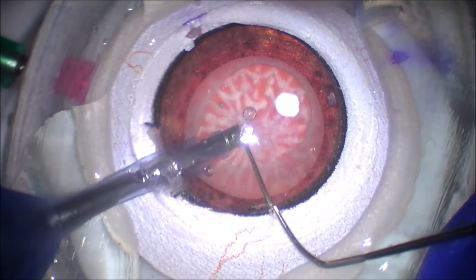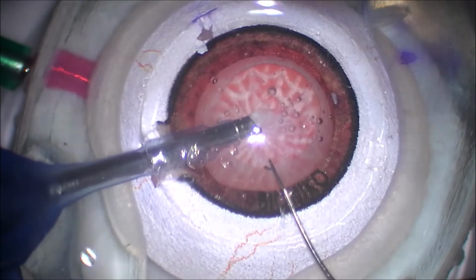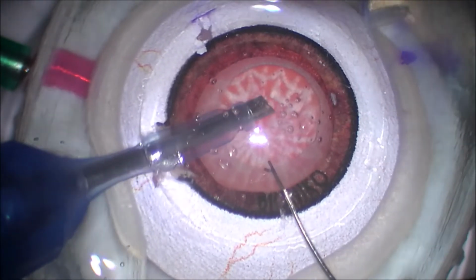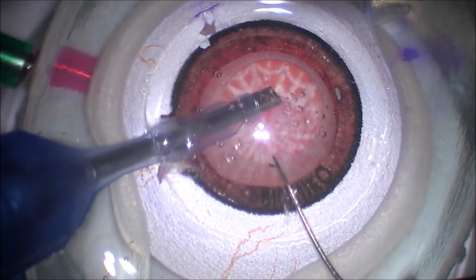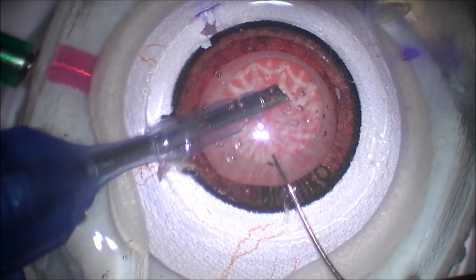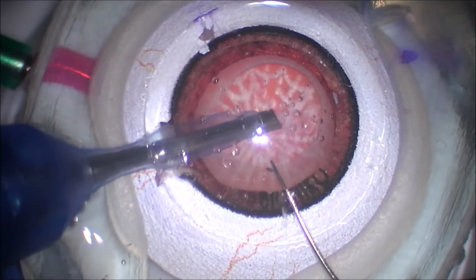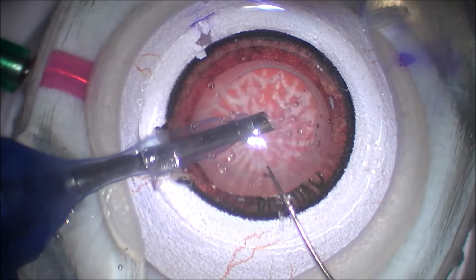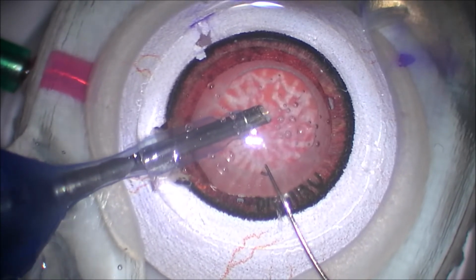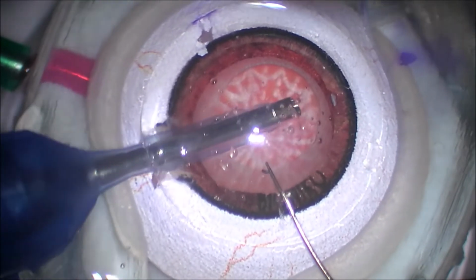And we don't have the actual head model for this exercise. And so what we had to do was we grabbed a large garbage bag, placed it over the headrest, and taped the garbage bag and a plate mount with the eye here, because there's a suction mount, and we taped it with surgical tape. And so it keeps that garbage bag open and allows the fluid to come out without making a big mess all over the floor.